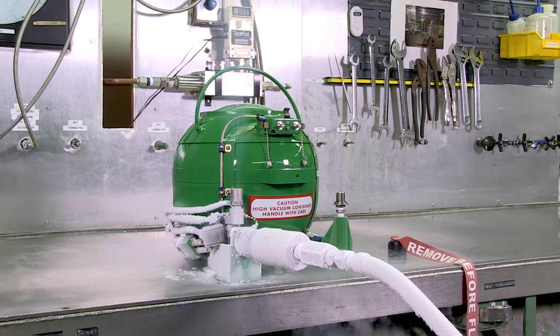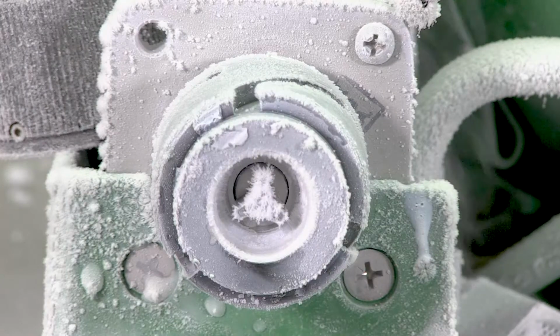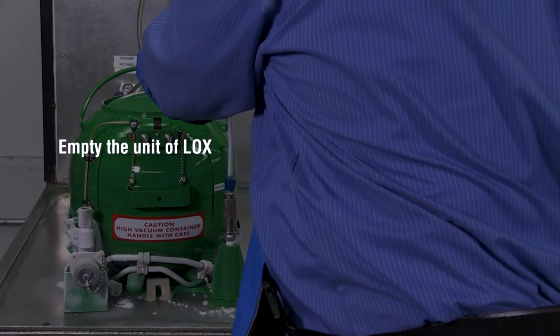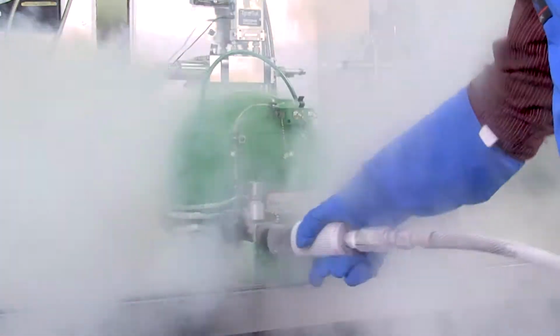Frost on the lines can occur during normal operation. These are all examples of normal frost that can occur. If frost is excessive, empty the unit of LOX and then perform a hot, dry nitrogen purge on the unit. After the nitrogen purge, refill the unit with LOX to see if the issue has been fixed.